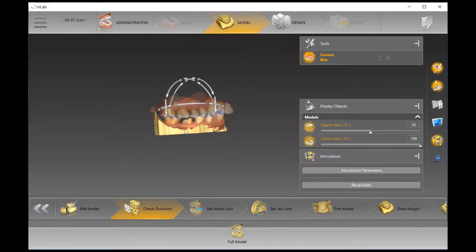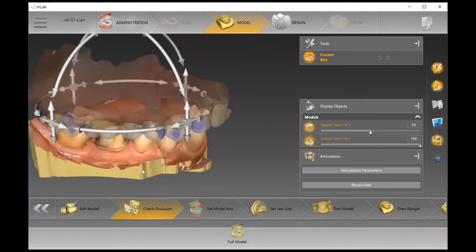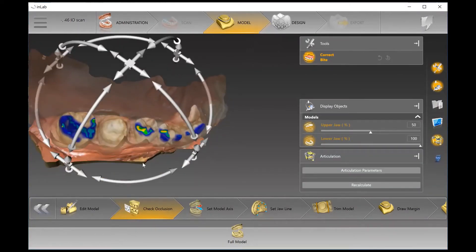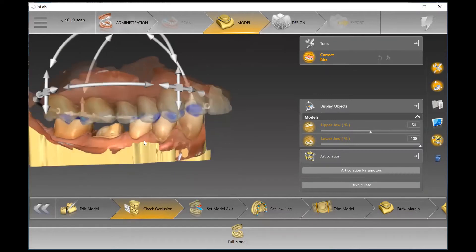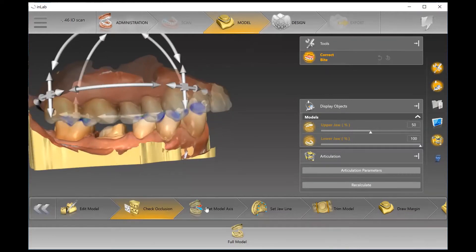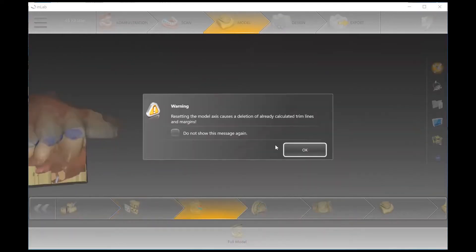In the Check Occlusion step, we're looking at the buccal bite scan to see the contacts — basically how the patient was articulating when they took the bite scan at the dental office.